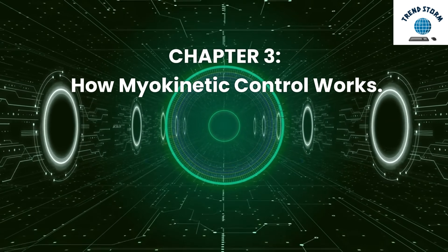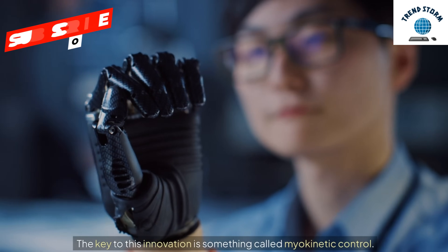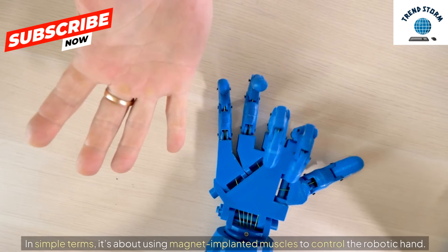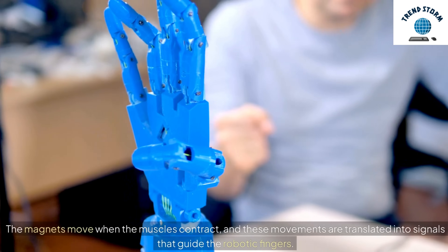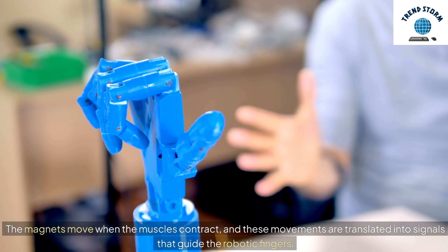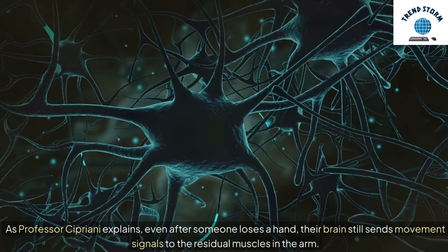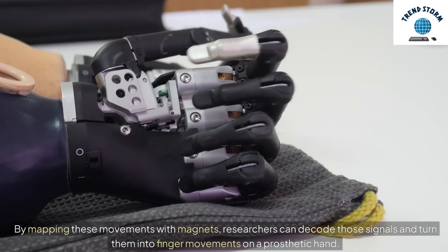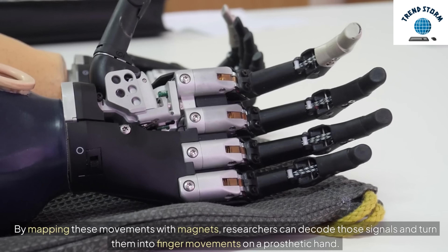The key to this innovation is something called myokinetic control. In simple terms, it's about using magnet-implanted muscles to control the robotic hand. The magnets move when the muscles contract, and these movements are translated into signals that guide the robotic fingers. As Professor Cipriani explains, even after someone loses a hand, their brain still sends movement signals to the residual muscles in the arm. By mapping these movements with magnets, researchers can decode those signals and turn them into finger movements on a prosthetic hand.